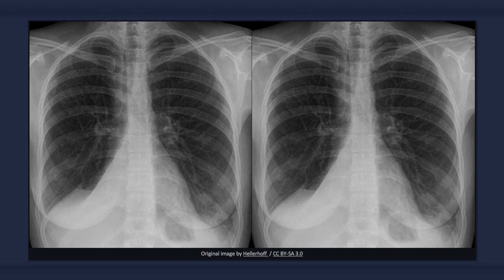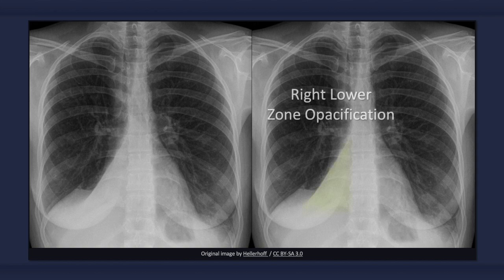When presented with an X-ray of a patient with right lower lobe atelectasis, the first finding that you may notice is an area of increased opacification. Atelectasis of the right lower lobe results in a triangular density medially at the right lung base.